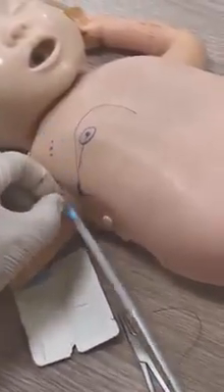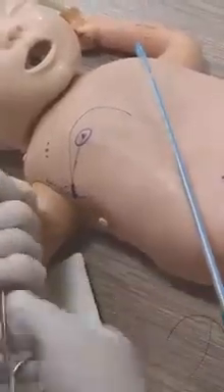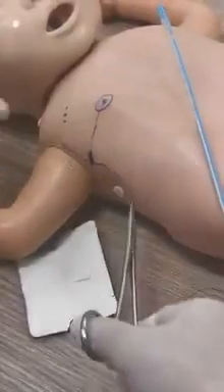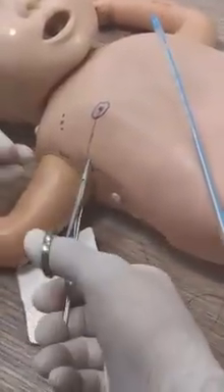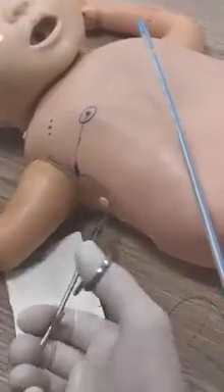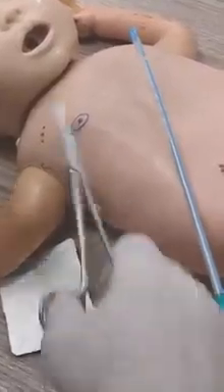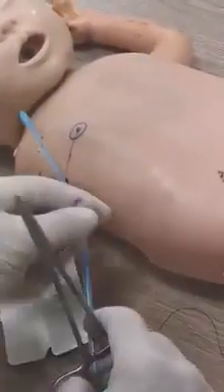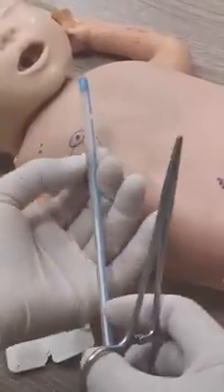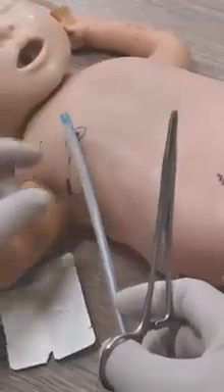Then, imagine this is inside, I will take my figure of 8 suture. This is the one. See, it will be like this. So now I close the skin over the ICD inside. So this is the figure of 8. I will take another stitch or whatever. Then I will wrap it over that. I already took the stitch here, but figure of 8, so it will be very strong and will not come out.